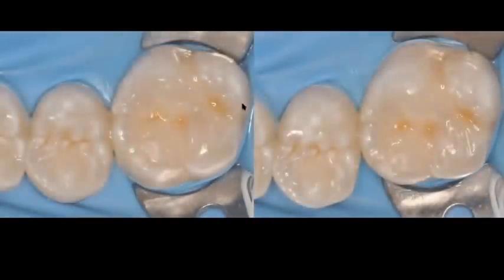And again, you can see the restoration has been completed. We've completed the occlusal. We've completed the lingual. I have a little bit more to go here on the lingual aspect. You can see it already restored on this photo. But look at the final anatomy without me using any burrs. If we look at this together, you can see that I've created enough chroma. I've created enough depth of my pit and fissure systems. I've created the ideal anatomical form of the tooth.